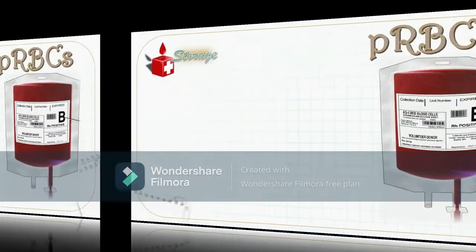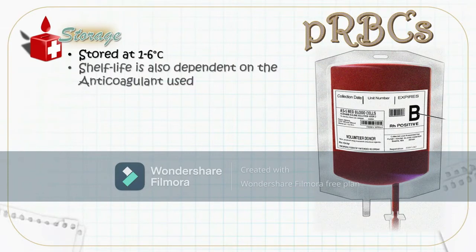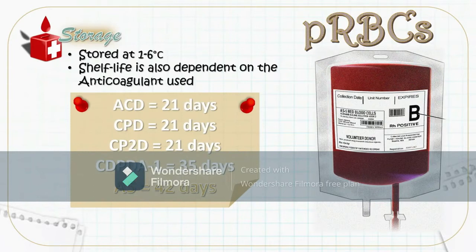As for its storage, packed red blood cells will also be stored at refrigerator temperature, approximately at 1 to 6 degrees Celsius. And just like our whole blood units, the shelf life of packed red blood cell units will depend on the anticoagulant used. Again, we have here the list of the most commonly used anticoagulants for packed red blood cells: ACD, CPD, CP2D, and CPDA1. And if you could notice, we have here an additional substance, which is AS, or additive solutions. If additive solutions are added to packed red blood cells, it increases the shelf life of this unit for up to 42 days.